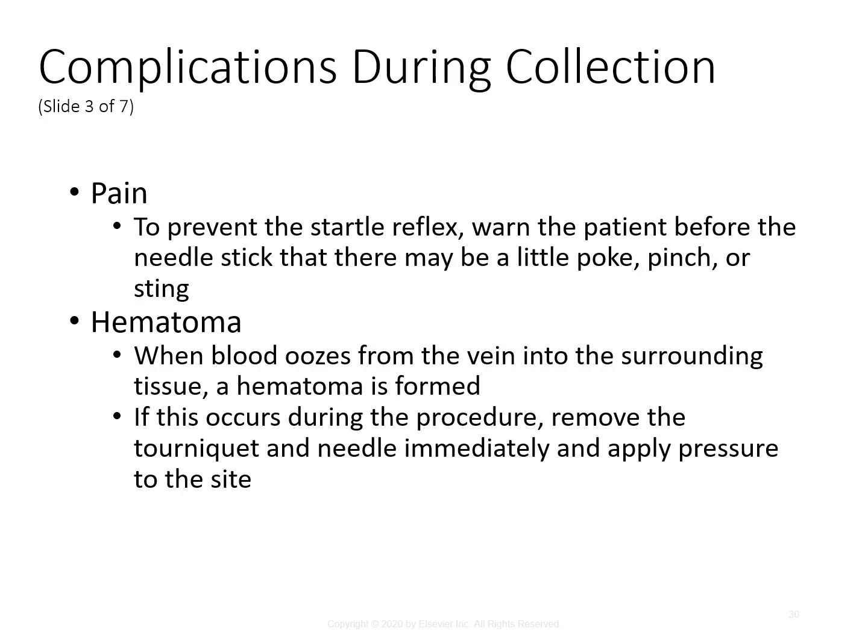Pain can happen, so to prevent the startle reflex, warn the patient before the needle stick that there may be a little poke, pinch, or a sting. That just lets them know what's occurring so they don't flail their arm up when you put the needle in, because that wouldn't be good either.